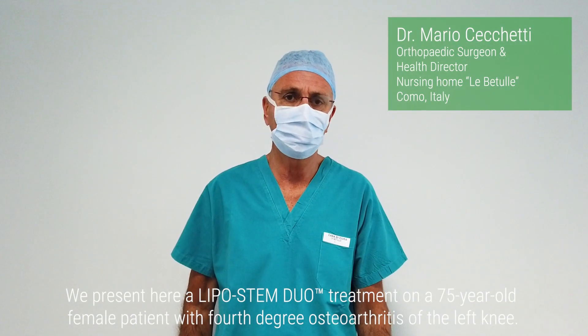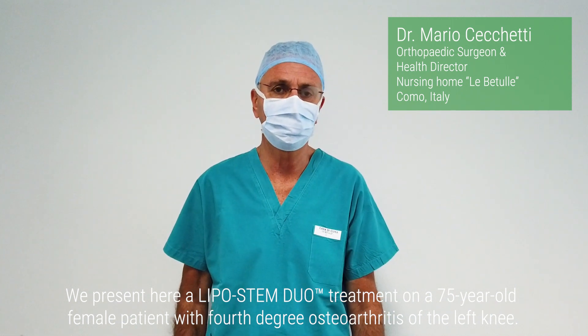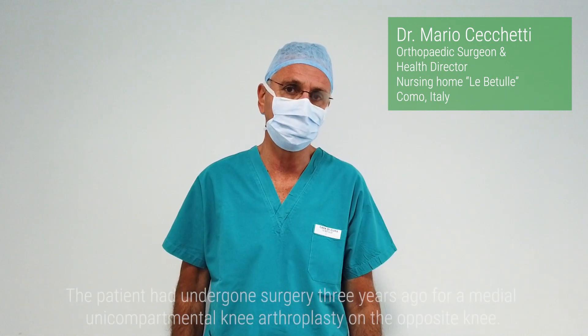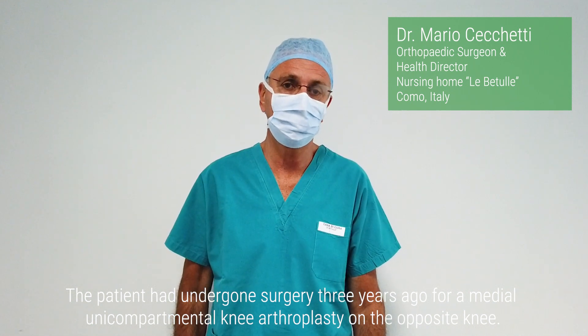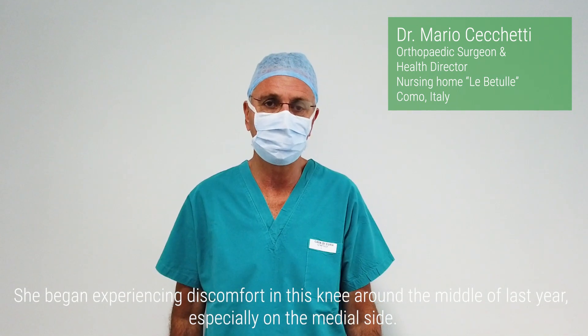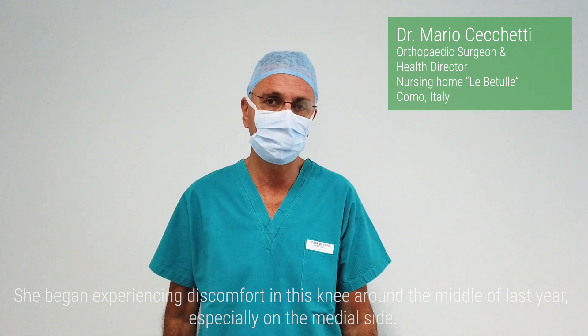We present here a Lipostem Duo treatment on a 75-year-old female patient with 4th degree osteoarthritis of the left knee. The patient had undergone surgery 3 years ago for a medial unicompartmental knee arthroplasty on the opposite knee. She began experiencing discomfort in this knee around the middle of last year, especially on the medial side.